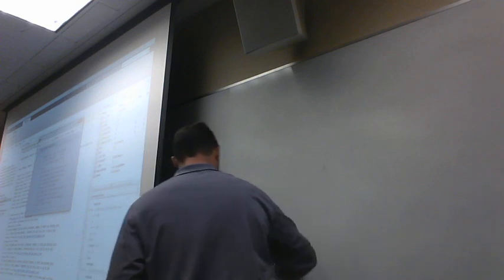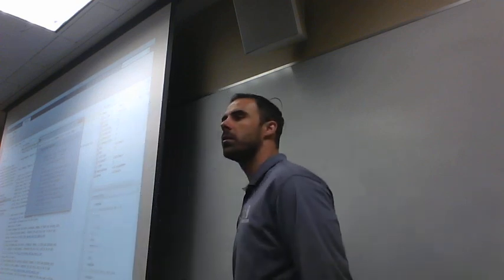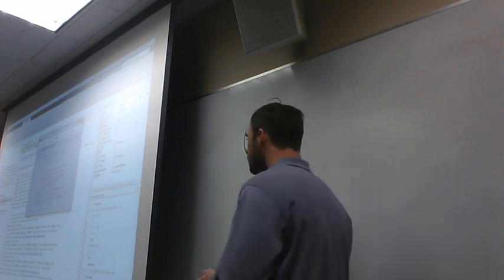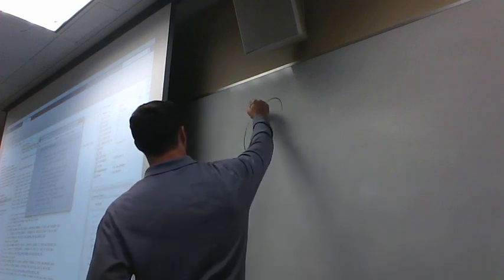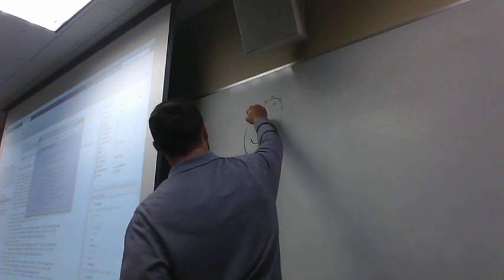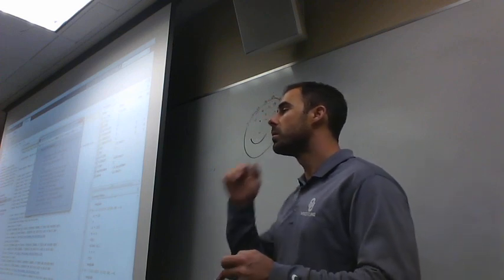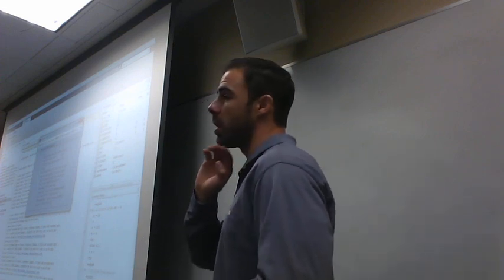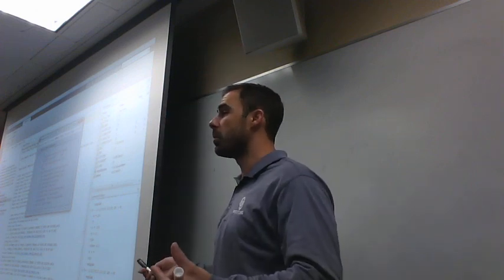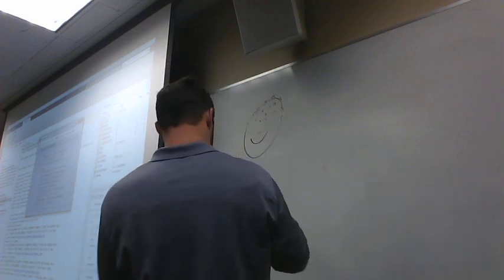Let's talk about exactly what's happening. You've got a person hanging out in an experiment. Now we're recording electrodes from all over the head. I'm just going to put these little circles here representing these electrode spots. It turns out there are 32 sites. Our 32 sites are recording from a cap that holds them in place at the same spots on everyone's scalp.